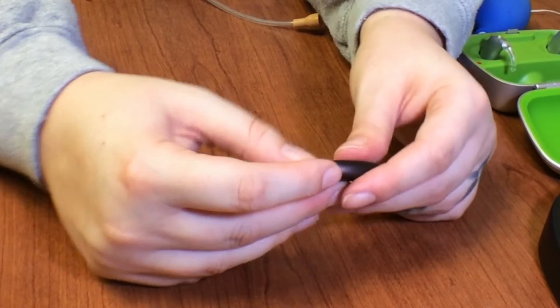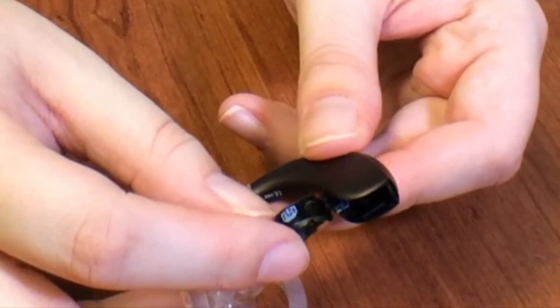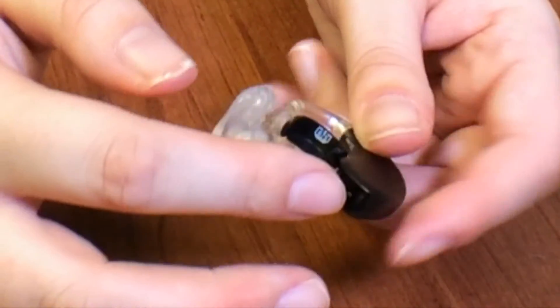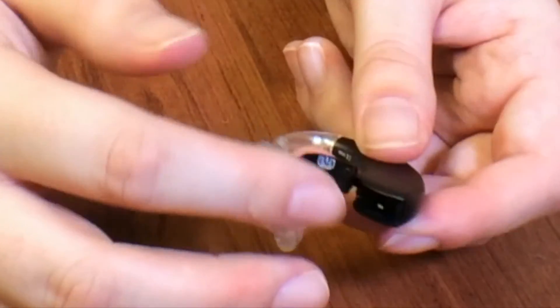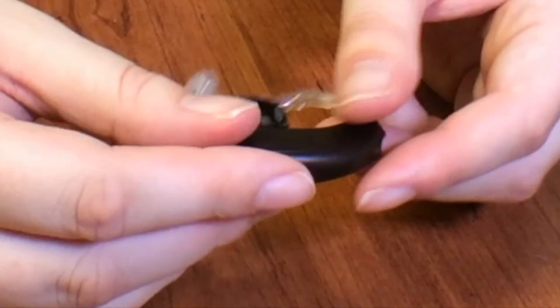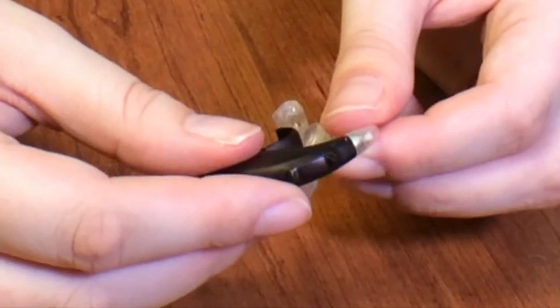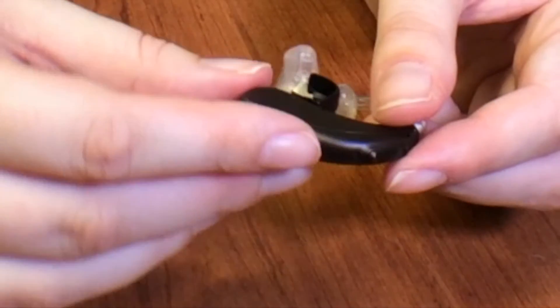The next thing that you want to do is check for corrosion down inside the battery door. If you do find any kind of debris or corrosion inside the battery door, you want to clean it out with a microfiber cloth. If it's really stuck in there, have the patient go to their audiologist so that they can clean out that device.